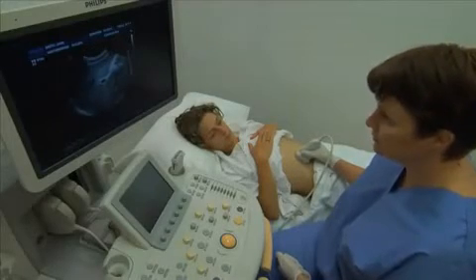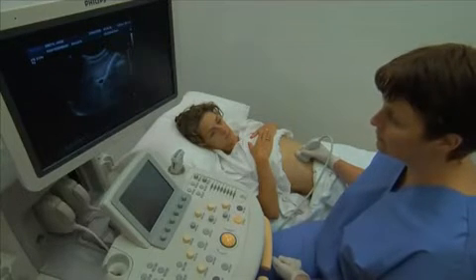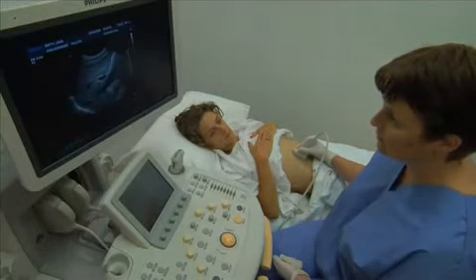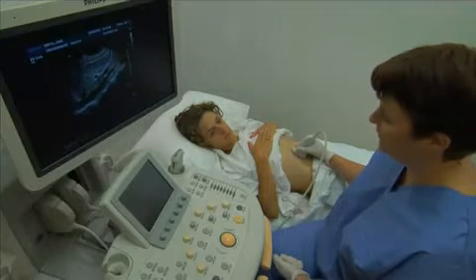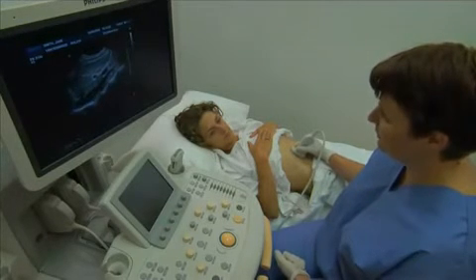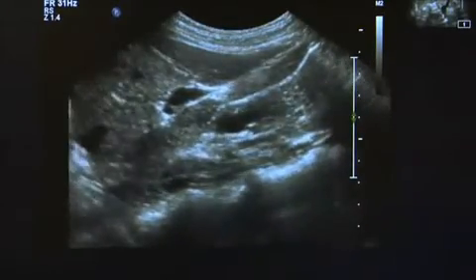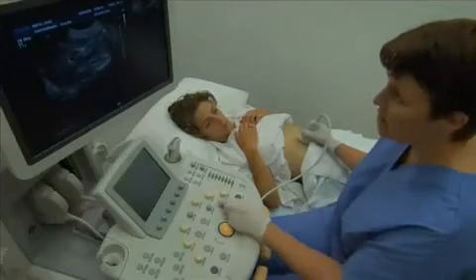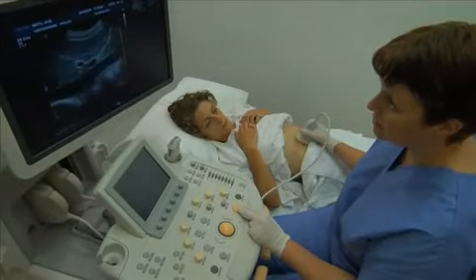Obtain longitudinal images of the liver with the patient in the supine position, taking note of any abnormalities. A series of six longitudinal images are recorded by making small incremental movements, starting from the left of the midline and moving along the right subcostal margin to the inferior border of the right lobe of the liver.